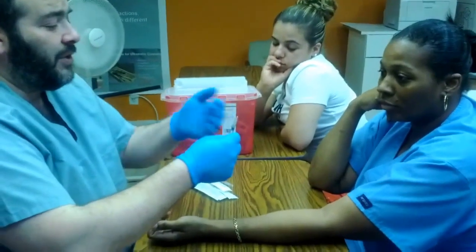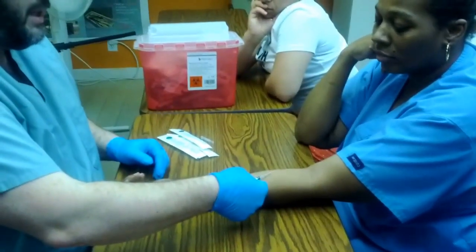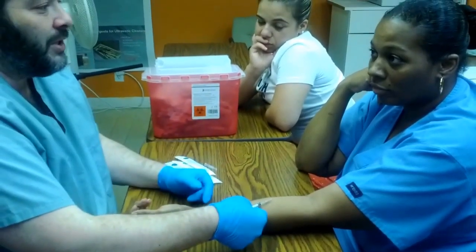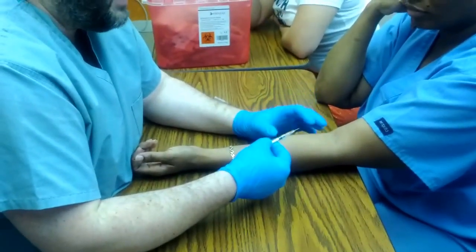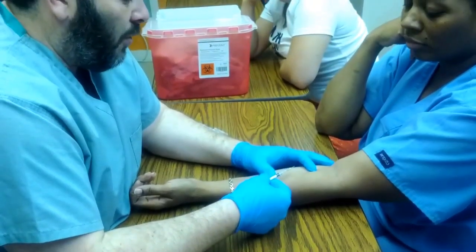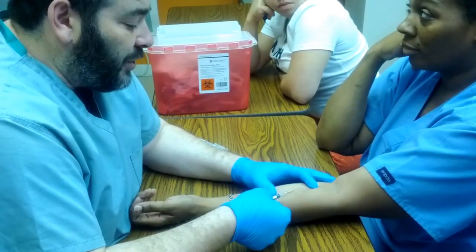The bevel of the syringe is to be facing you. If I lay it down on your arm just like this, the bevel is going to be facing up. All injections are done with bevel facing up. Here's the important part of this injection. You take your left hand or non-dominant hand and you stretch the skin, okay? Then all you have to do is lay the syringe down in the direction of the stretch, just like so.